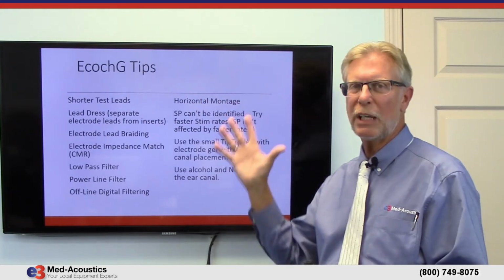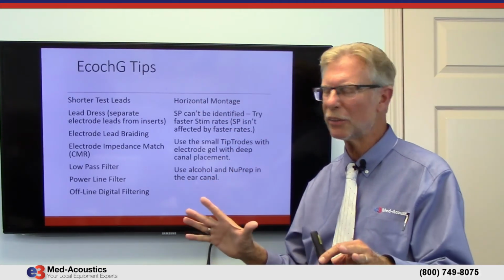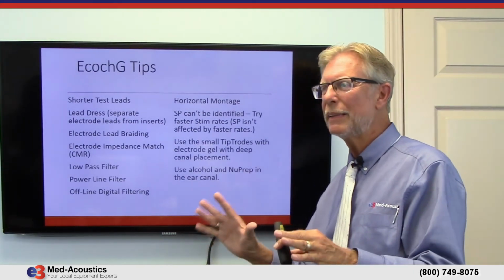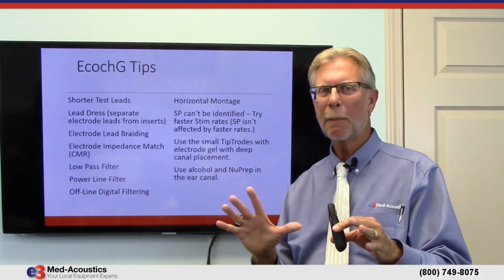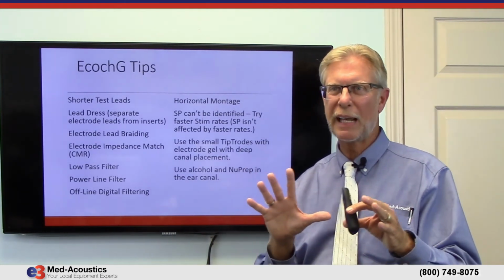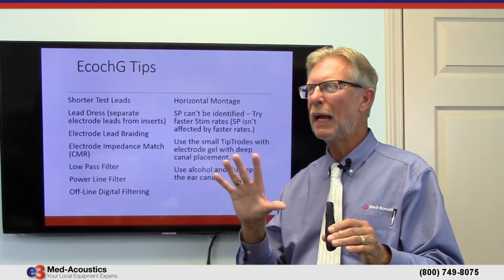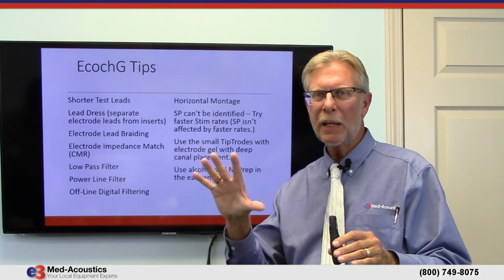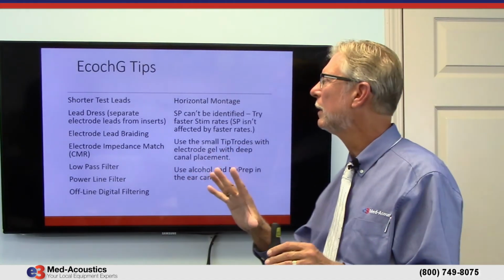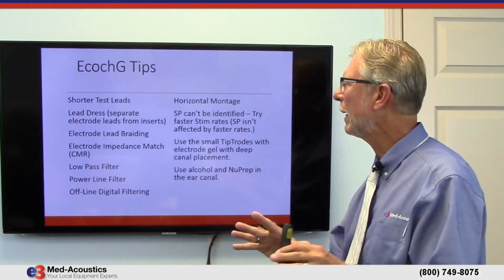Okay, these are some tips for people who do ECochs. I've been doing this for 40 years, so I have seen all kinds of problems. Today, with our equipment, with the type of processors that we have, digital processing that has evolved through many algorithms over the years and has become so high performance, noise immune, we're getting much better results. We're able to do things that couldn't be done in the past.